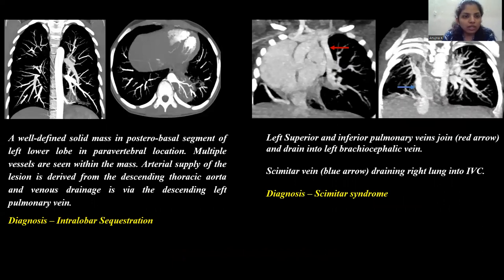Axial and coronal contrast-enhanced CT images show a well-defined solid mass in the posterior basal segment of the left lower lobe in a paravertebral location. Multiple vessels are seen within the mass. Arterial supply of the lesion is derived from the descending thoracic aorta, and venous drainage is via the descending left pulmonary vein. This is a case of intralobar sequestration.